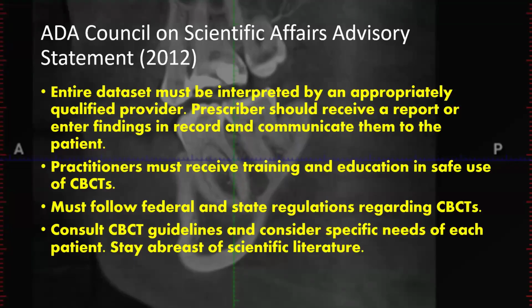Following that focal trough. Now we're looking at cone beam CT, and in these medium to large fields of view, you see all those skull base foramina. You can see lymph nodes when they're swollen, and to some degree, you can see those soft tissue outlines as well as all the osseous structures, right?